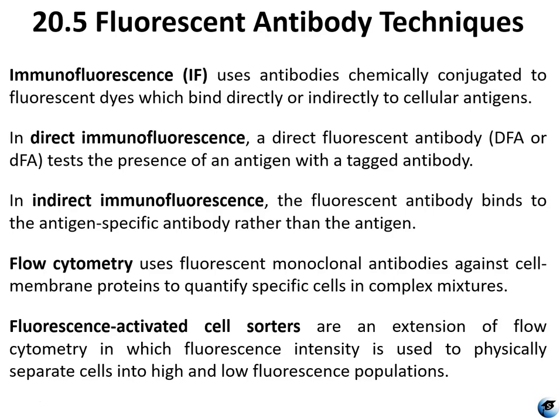In direct immunofluorescence, a direct fluorescent antibody, also known as DFA, tests for the presence or the absence of an antigen with an antibody that has been tagged with a fluorescent dye. In indirect immunofluorescence, you can test for the presence of antigen-specific antibodies rather than the antigen themselves.